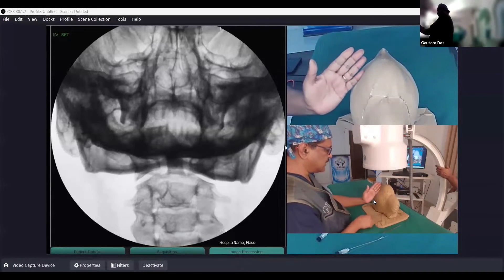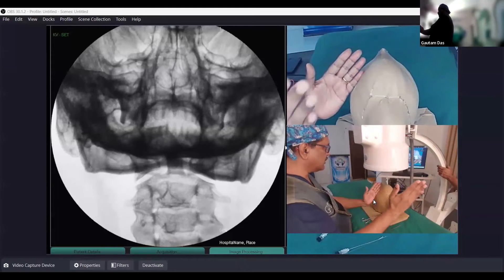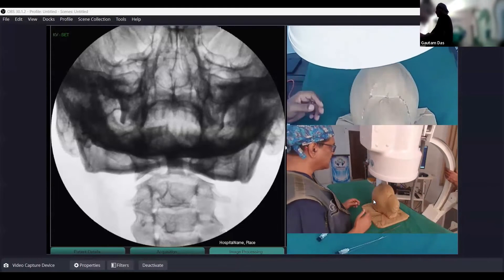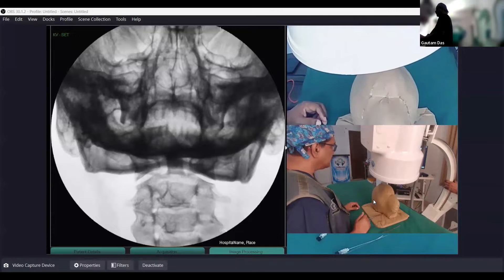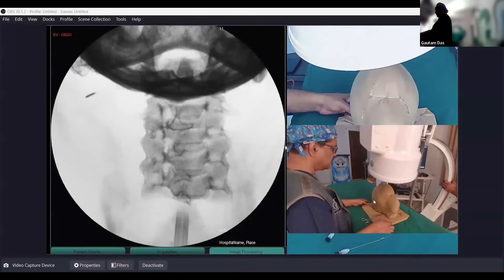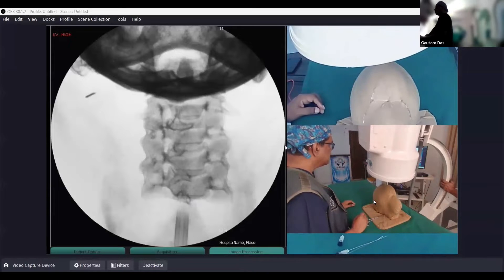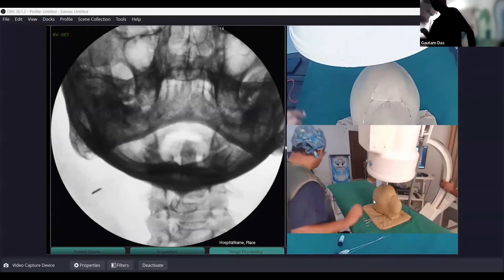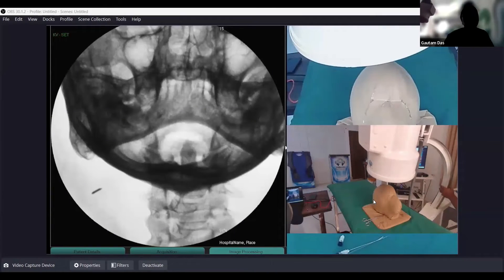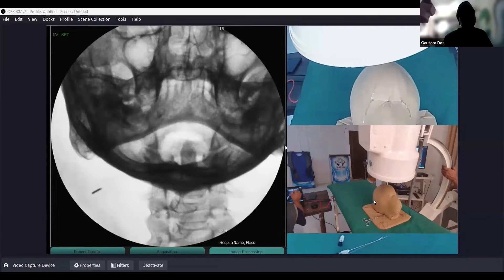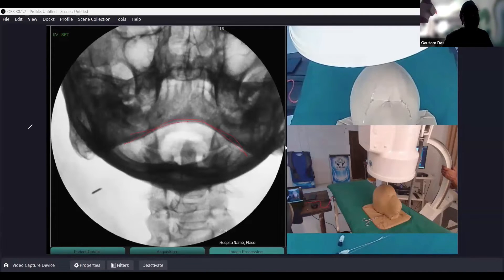On the manikin demonstration: you are looking at the base of the skull, so you need a caudal tilt — look from the caudal end until the lower border of the mandible looks like an inverted V. You can see it is now looking like an inverted V, but I need to make it more oblique to see a more prominent inverted V.